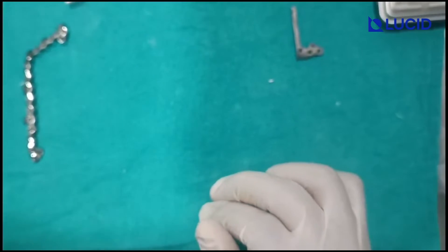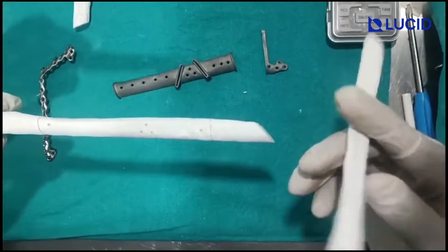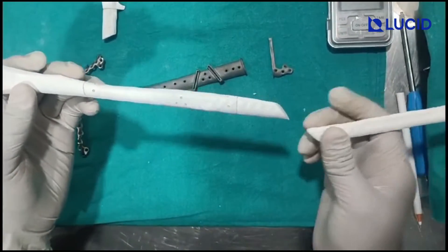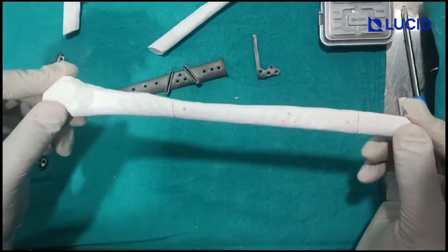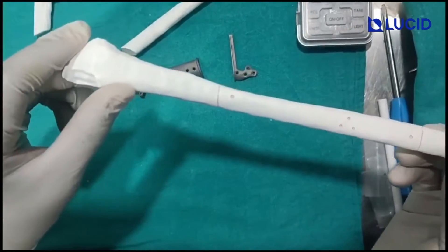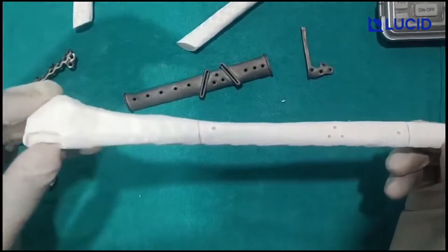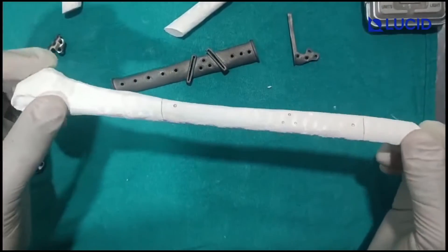Point number 2 is: these are — this is the whole fibula bone like this. Now this is in two pieces. I have printed two pieces separately. We are concerned with this part of the bone. This is the left fibula of the patient, and this is the distal end — that is the ankle end of the patient.